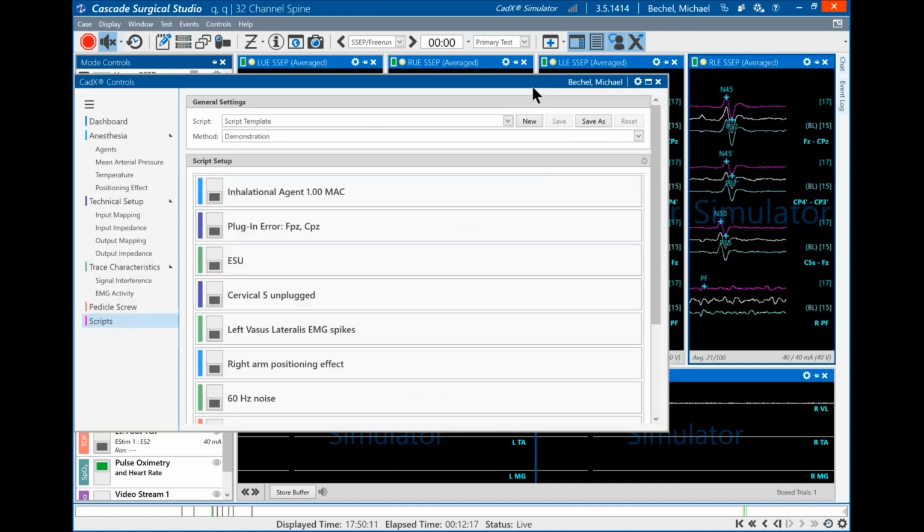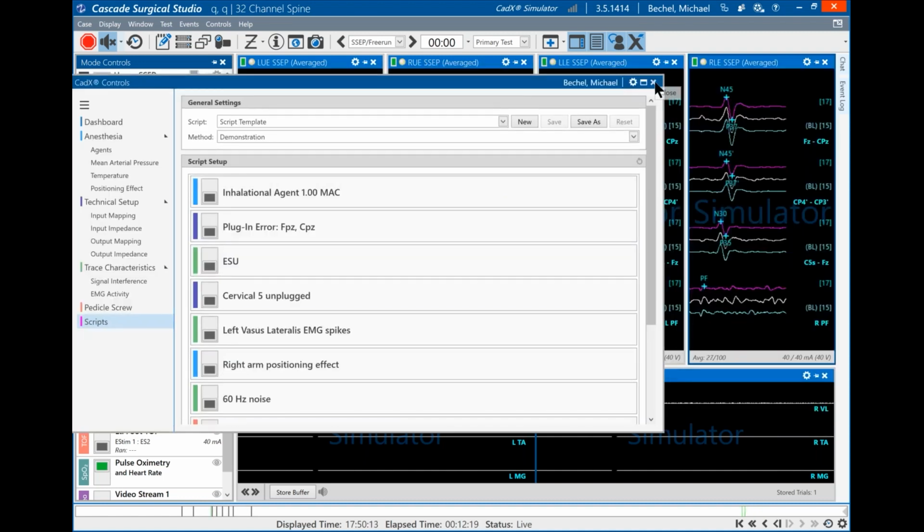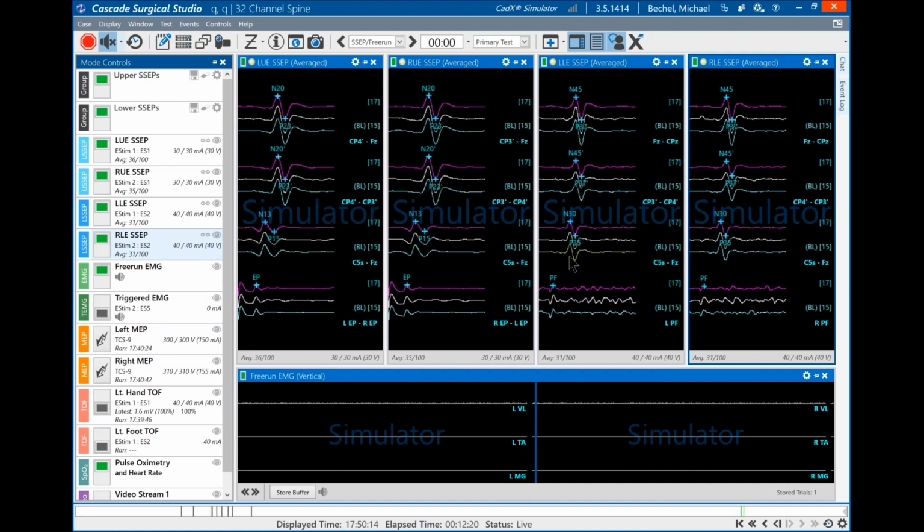Okay, I'll close scripts. And once again, free, go to our website, our support site, get the information, look at the training. I think you'll find those items to be very useful.